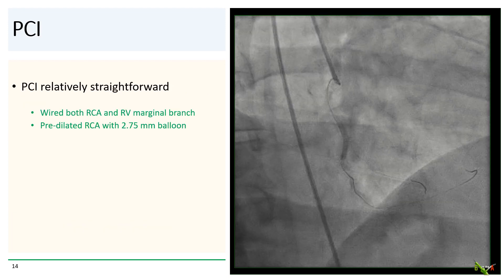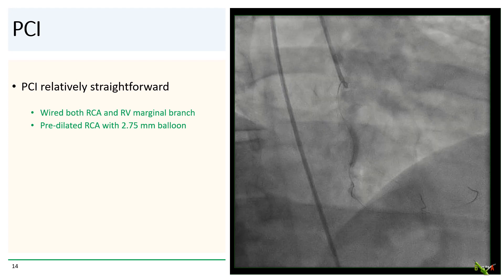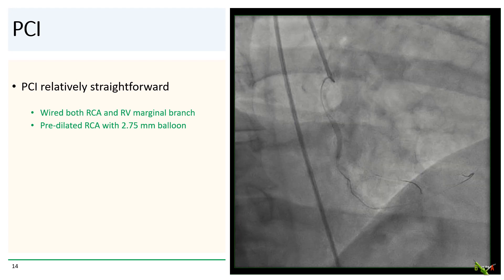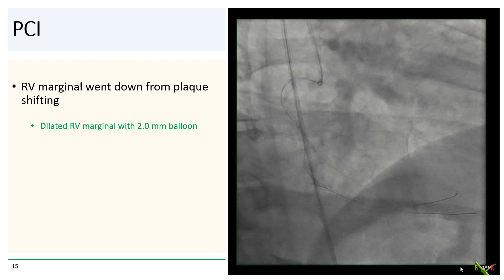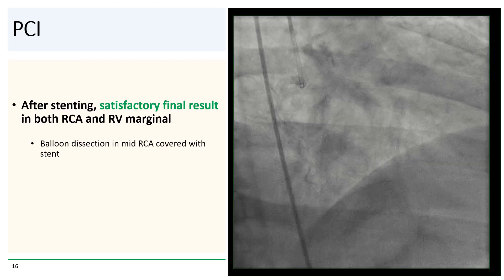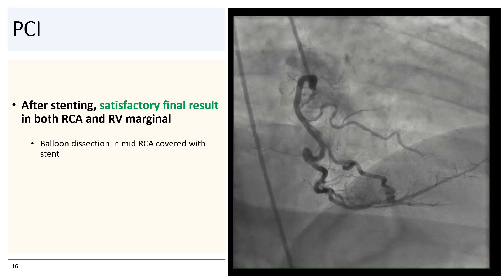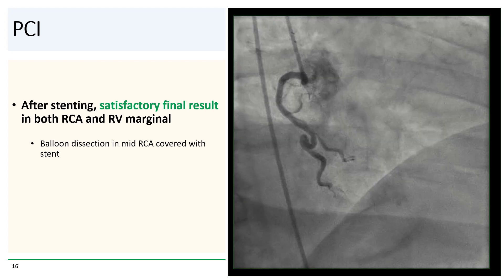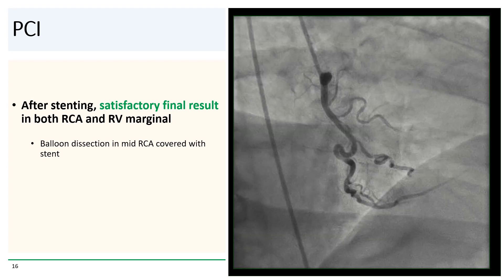The intervention was relatively straightforward. We wired both the RCA and the RV marginal branch and pre-dilated the RCA with a 2.75 millimeter balloon. After pre-dilation, the RV marginal branch actually went down, so we were thankful that there was a wire in place already. We dilated the RV marginal branch with a 2.0 millimeter balloon to re-establish flow. After stenting and post-dilation, we have a satisfactory final angiographic result in both the RCA and the RV marginal branch. There was a balloon dissection in the mid-RCA that is now nicely covered by the stent.